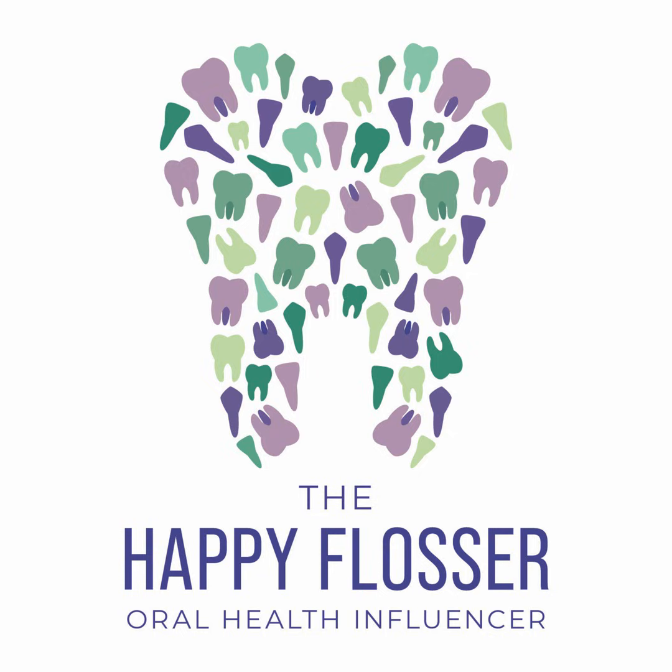So you want to be really strategic as you work yourself through a full mouth series of x-rays. You will find that there are some challenges. What if my patient has really long roots? You will learn to adjust the vertical angulation by tipping the PID toward the crown in order to achieve an image of the roots of these teeth. A couple of additional tips.